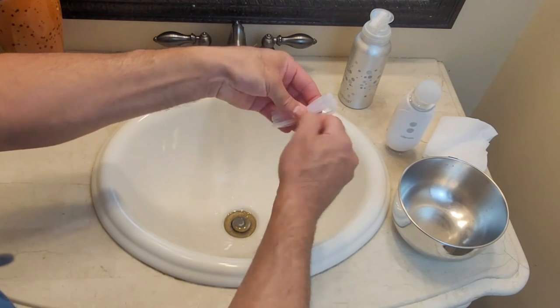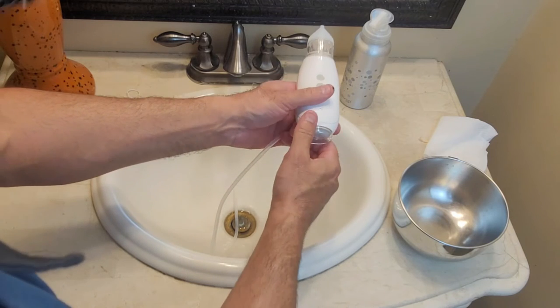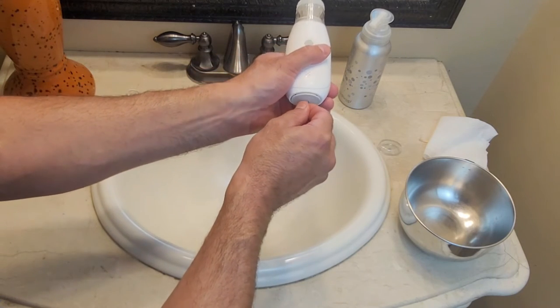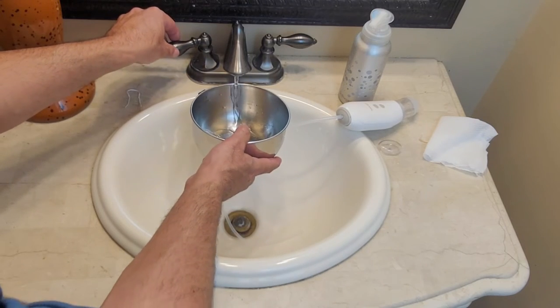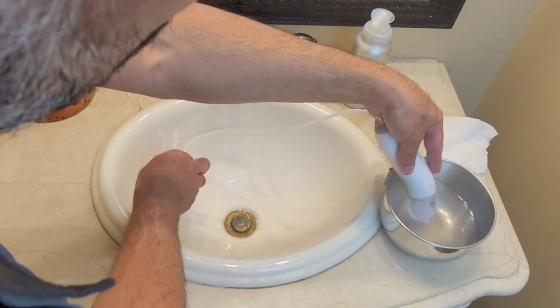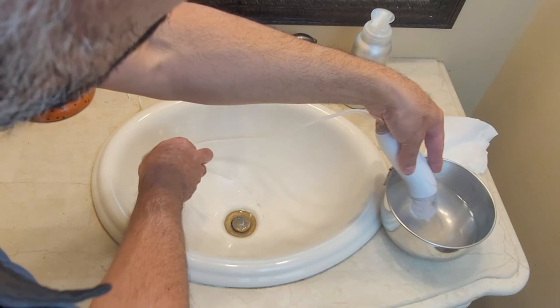Grab your extra tubing, remove the base cover here from your device, attach your tubing right here to the bottom, fill a small container with some water, turn on your suction device, and you can suction the water through the unit to rinse it out just like that.